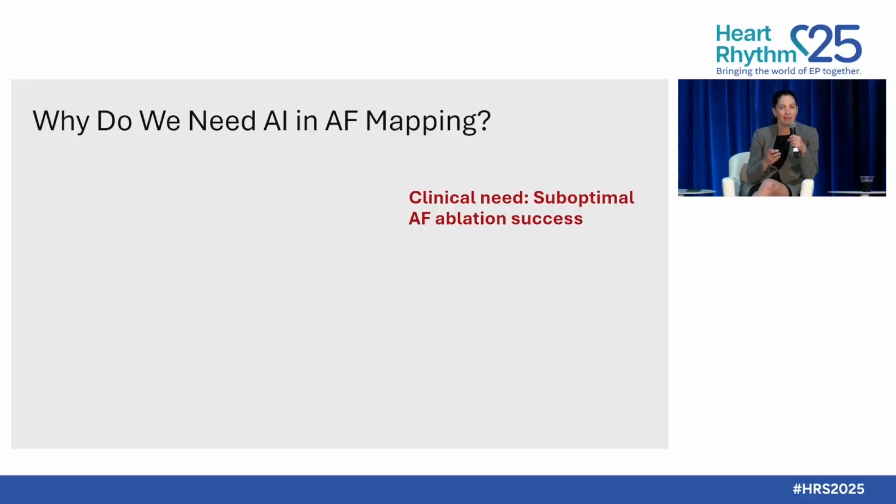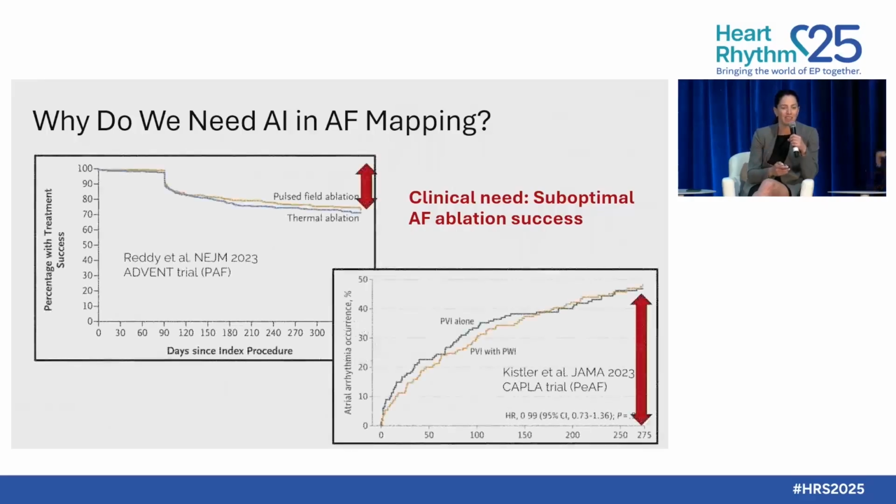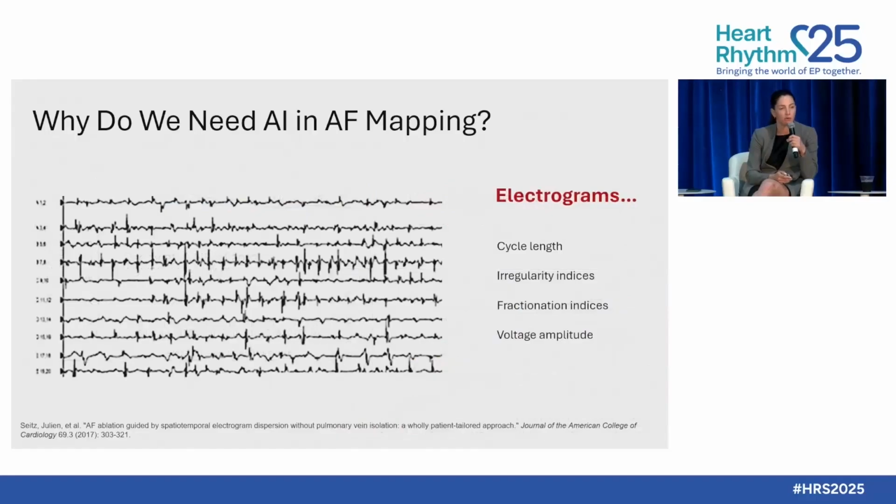We are not happy in how we're doing AF ablation these days. Paroxysmal patients, persistent patients, with the newest, latest technology, there's still a lot of recurrence that we're dealing with in any cohort we're dealing with.